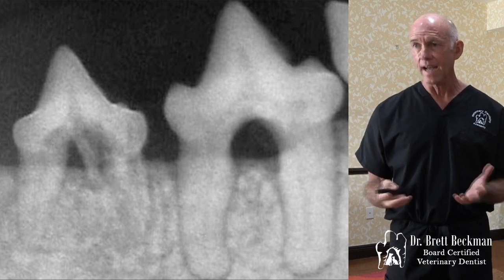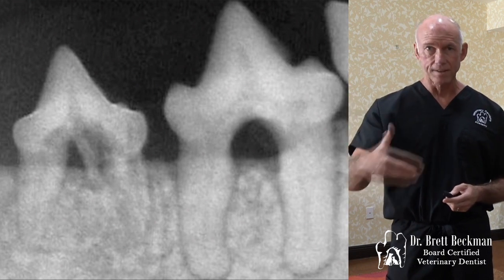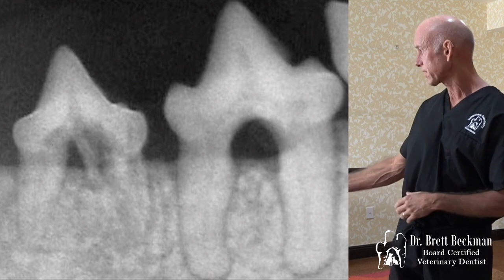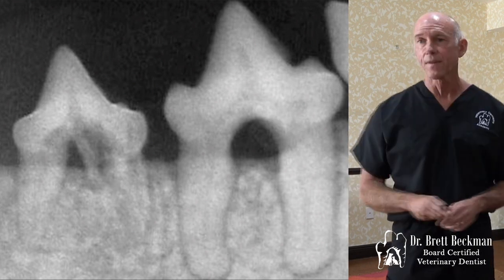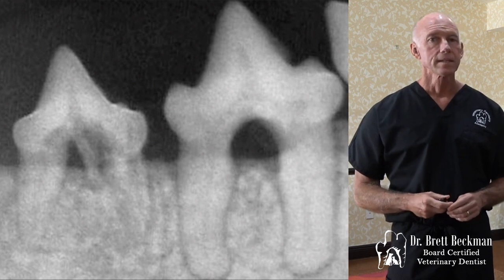And that tooth is non-vital, but there might be some inflamed tissue in the pulp cavity that's a remnant of the pulp that we want to get out of there. And it's not going to go much further than halfway down that tooth root, but get it out of there just to be safe. Yes?